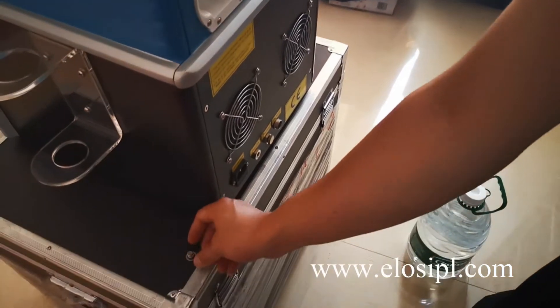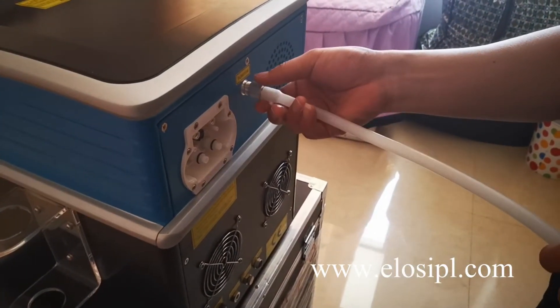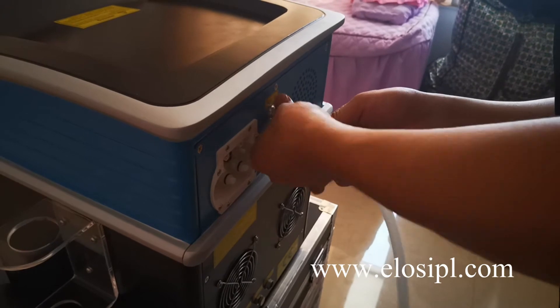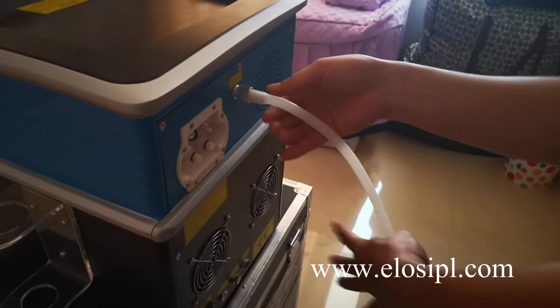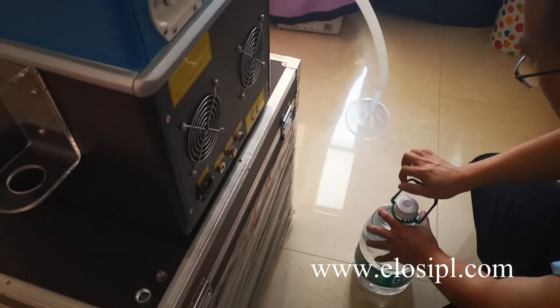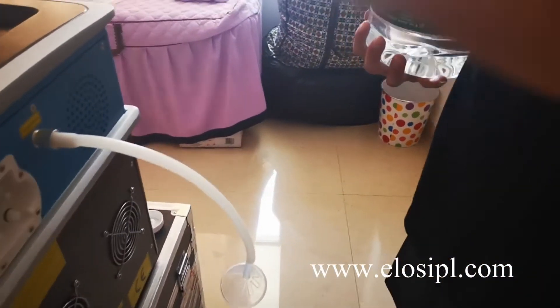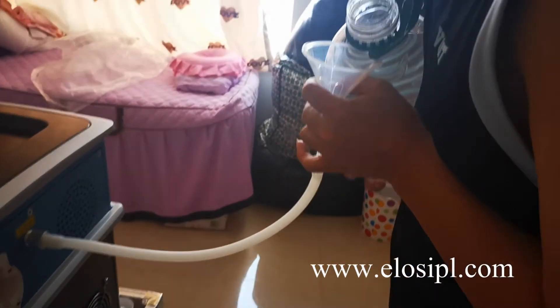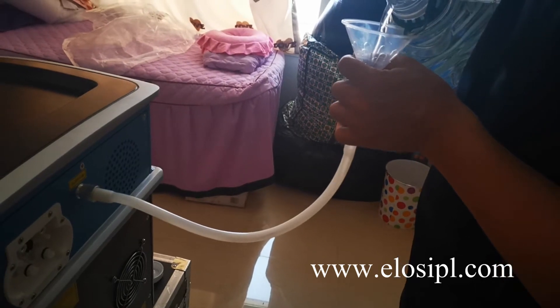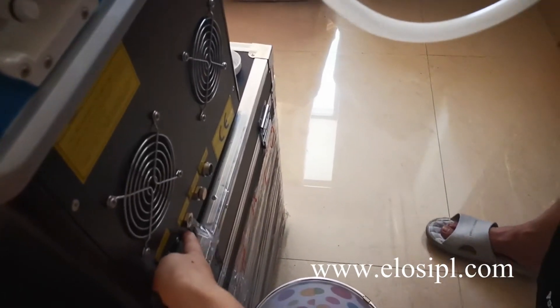Take off the cap of the water overflow and insert the water funnel into the machine. The water must be distilled water or purified water. When there is water coming out from the water overflow, it means the water is enough.